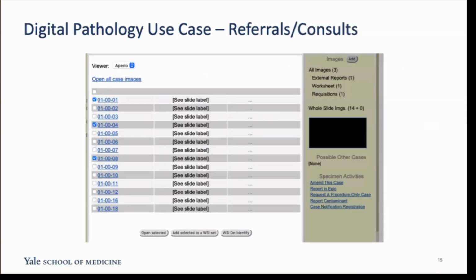And in practical terms, this is how it looks. Here you're seeing a snapshot of an X case that has 14 whole slide images associated with it. If you click that, a dialog box pops up, and we have the option to review all the cases or selected slides, similar to the workflow that I showed earlier on that test patient.